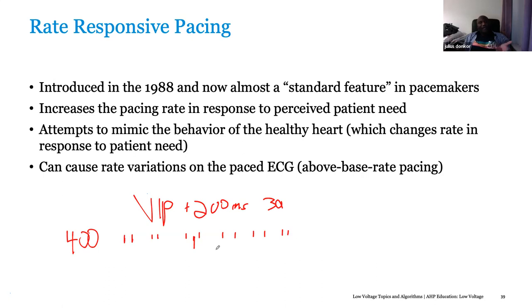So Medtronic has AAI to DDD, Biotronik is DDD with ADI, and Boston Scientific has something called RhythmIQ, which does what VIP and MVP do. But the older Medtronic ones do not have it. Azure definitely has it, and Sphera also has AAI to DDD. So most of Medtronic nowadays have got that mode, AAI to DDD.